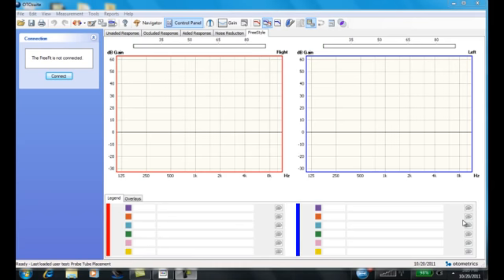I'd like to note that the issue that some of you encountered with the Oracle, where an error message would randomly pop up saying something to the effect that real ear measurement is not supported, please contact your vendor, that issue has been taken care of. Previously, the only solution was to disconnect and reconnect the power. That is no longer the case. Version 3.5 has taken care of that.